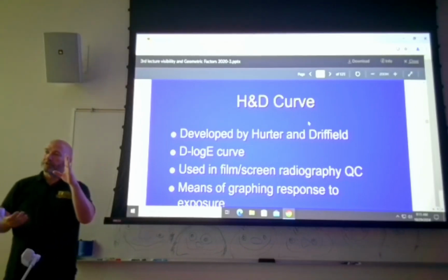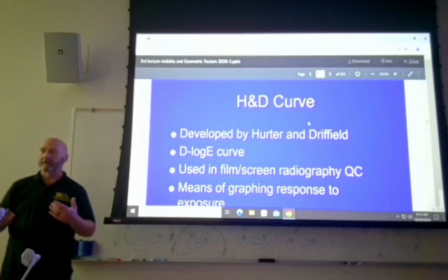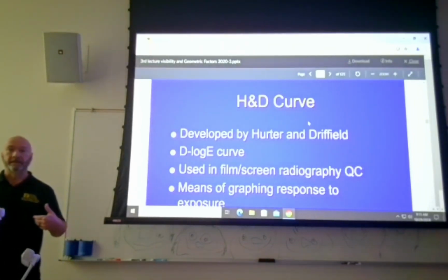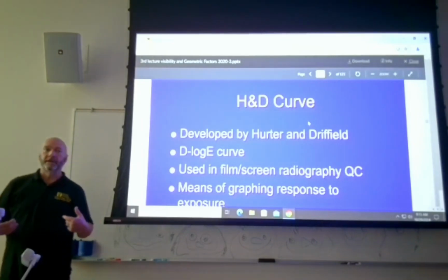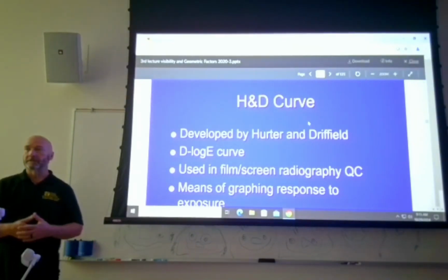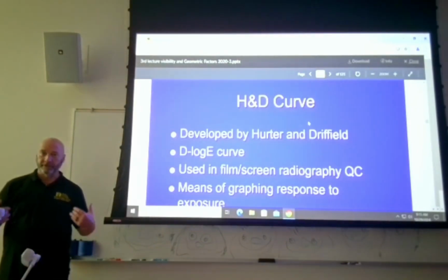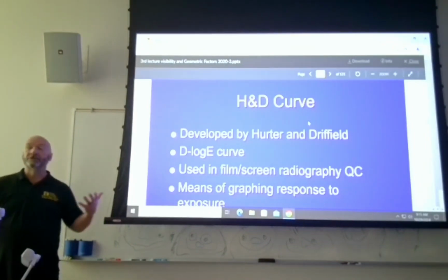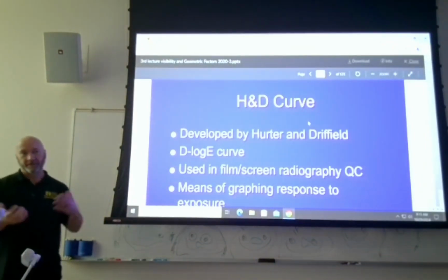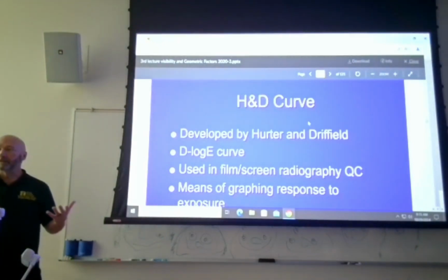So a very vertical H&D curve would be representative of things like rib x-rays, let's say, because you want to see the bones, right? You want to see the bones in the rib x-rays. You're not interested in the lung markings. But same anatomy, thoracic viscera, thoracic cage anyway, the chest, I say, because I just went from soft tissue to bone, the chest, right?